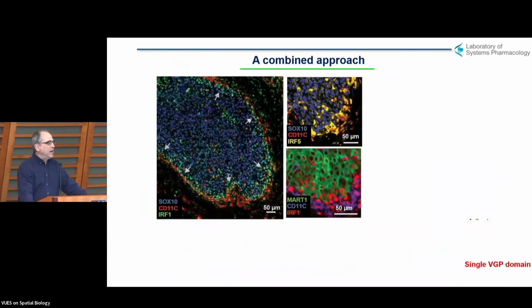So let me just give you an example of this. This is actually a couple of channels from a high-plex tissue image. You can see this is a couple of hundred to 1,000 cells shown here based on the spatial scale. What you're looking at is a thumb of invasive melanoma, which is in blue, sticking down into the dermis.